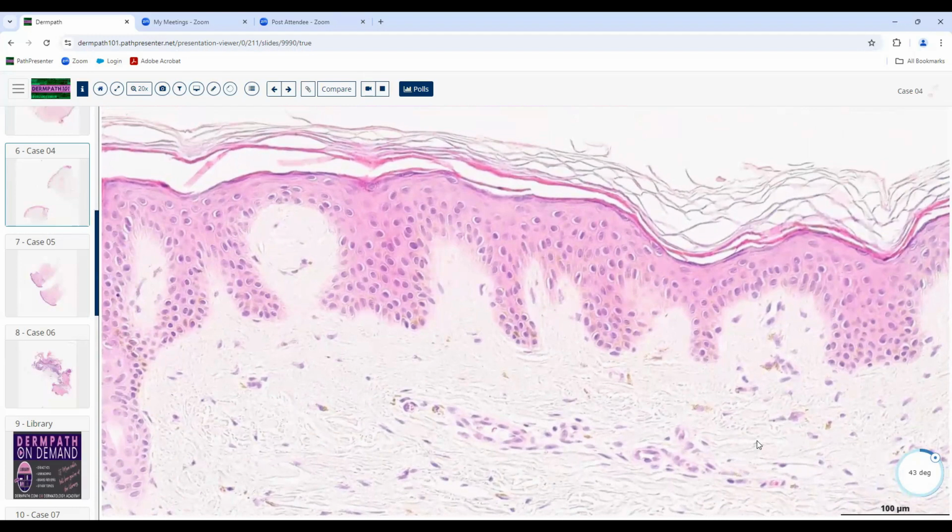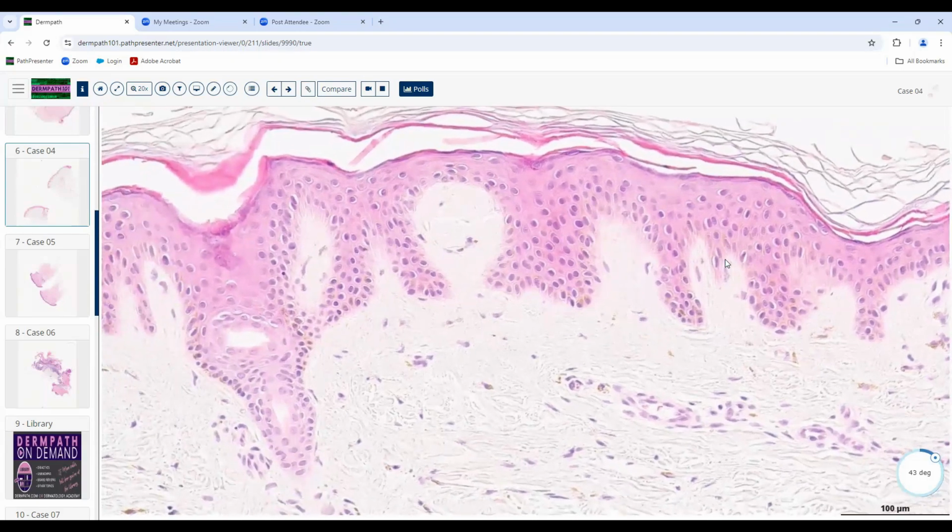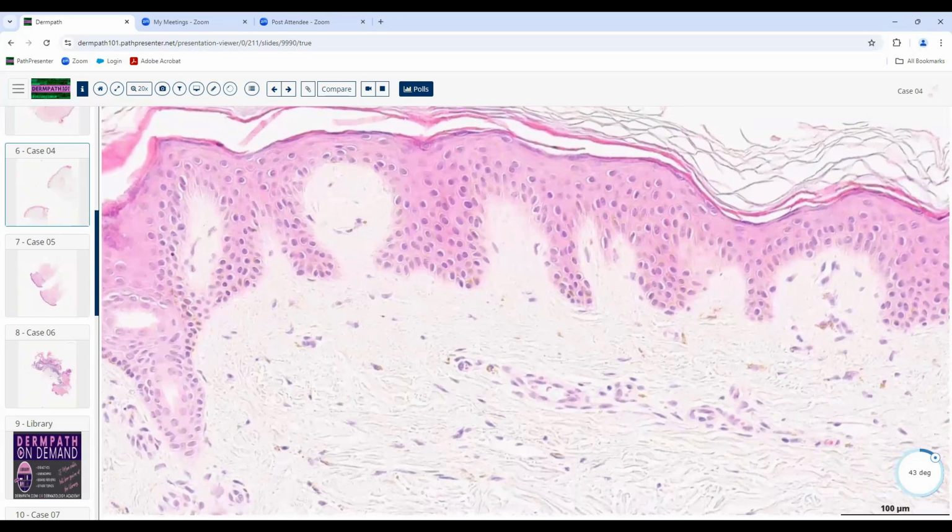Now, in this case, it would probably be more likely macular amyloid. And why do I say that? Well, mainly because it's got a basket weave cornified layer. When we see patients that have lichen amyloidosis, it's really basically the same process as macular amyloidosis. It's obviously an itchy condition. They rub the skin, they get massive lichen simplex chronicus overlying it, and we really don't have that here. We just have a basket weave cornified layer. So this is probably macular amyloidosis, and the clinician may have had a differential diagnosis. They might have biopsied a brownish reticulated appearance, say on the back.